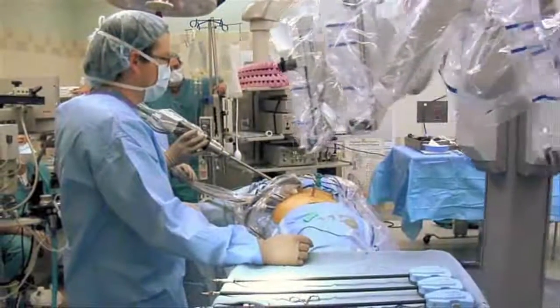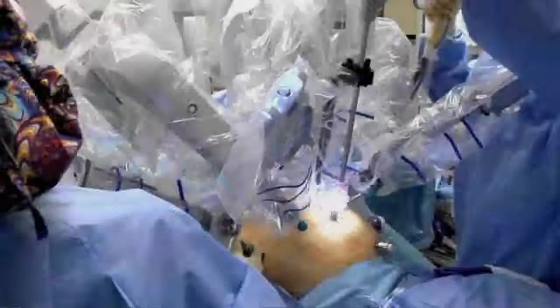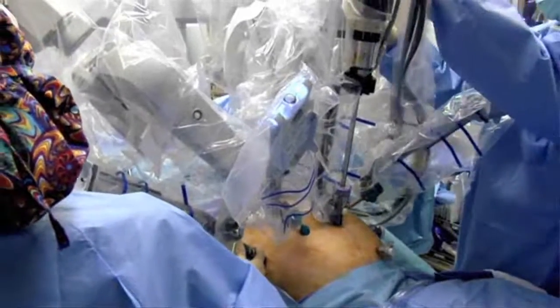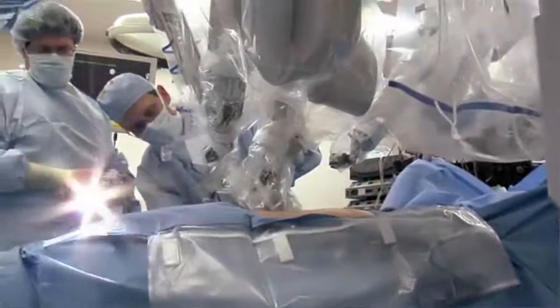The second part of the procedure is bringing the robot up to the bedside. That's the point at which we dock the robotic arms to the ports that have been placed in the patient's abdominal cavity. Following the robotic docking, we place the instruments in the abdomen and guide them down into the pelvis where the ovaries are.